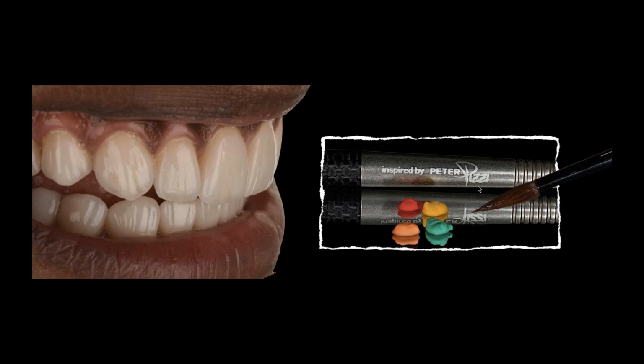Yeah, so I seal all my refractory dies for any ceramic. I'm using the GC connector paste. I think it's the only company that still makes that paste, to be honest with you. And I'll be honest, Kyle, I don't know I need it. I just do it out of habit at this point. In truth, I think all the connector paste is kind of like a glazy type material that's firing at a higher temperature and bonding into that refractory die.